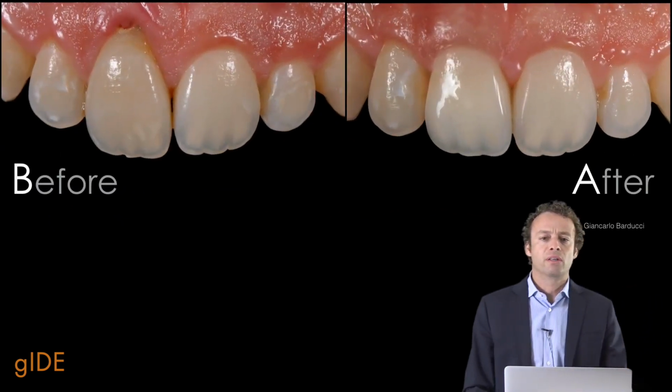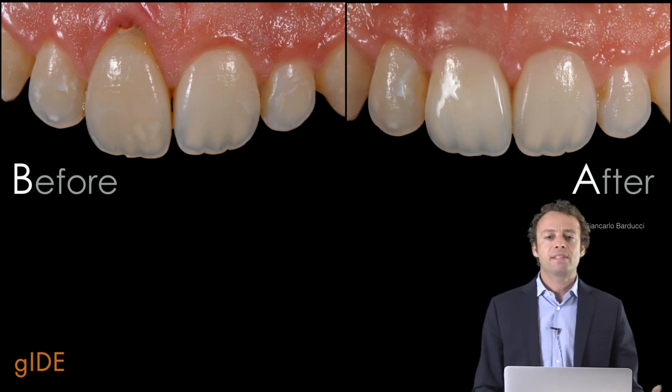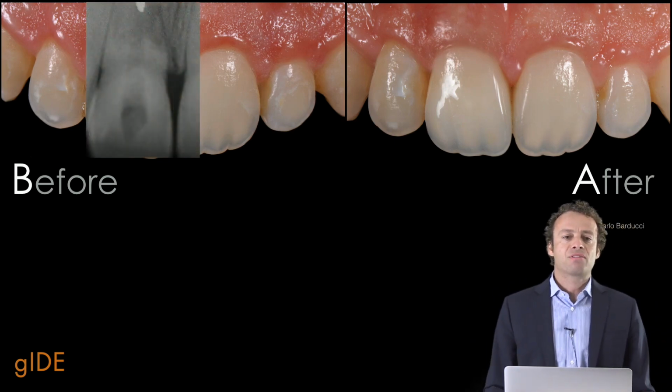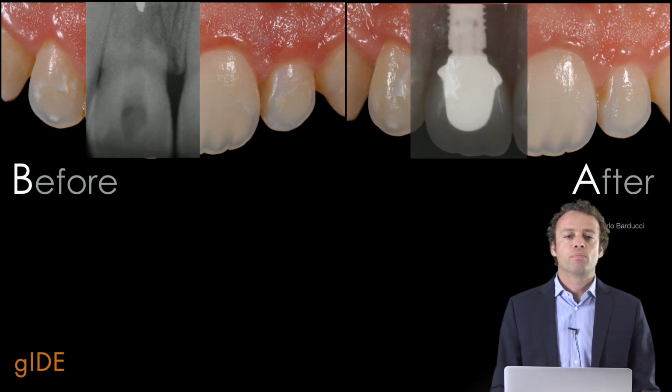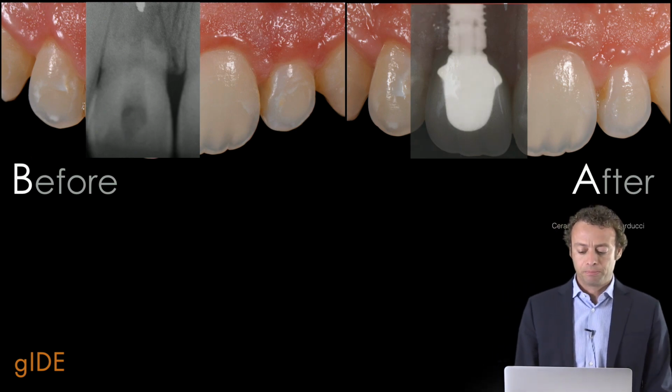And if we work in the right way, we are able to achieve this kind of good and stable aesthetic result. Here we can see the X-ray, we can see the baseline, or better, the situation before the treatment, and now we can see the final result.